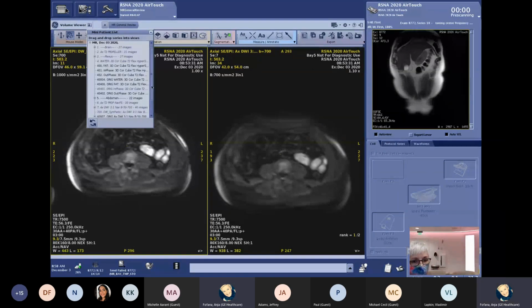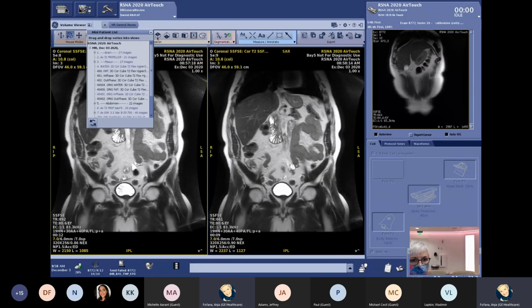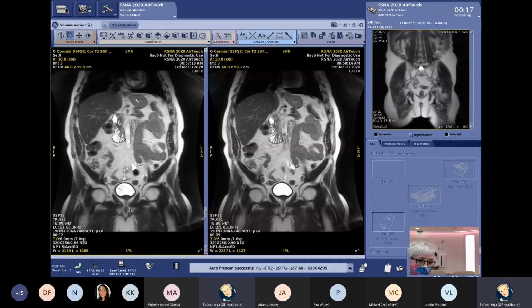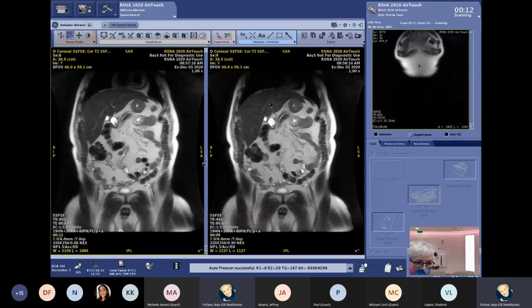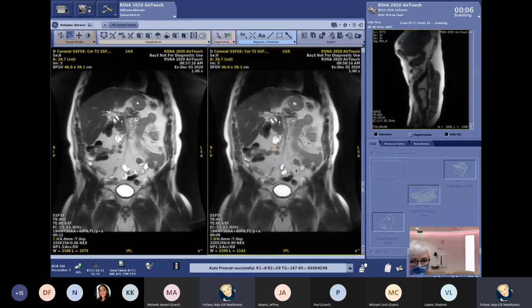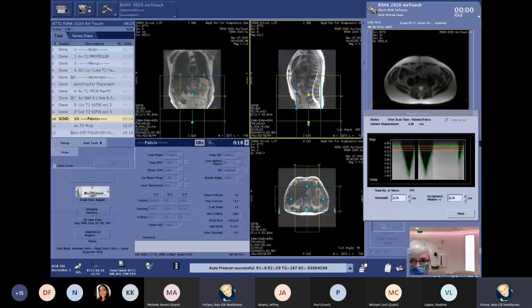So then I can go ahead and we can compare the two single shot sequences we just did. Remember, we picked a large field of view. And what we did here is we can cover the liver and the pelvis with one coil. You see, we are almost halfway in his femur here in one scan. And the difference between those coils is the acceleration factor. So on the left hand, let me just quickly prescribe the slice in the prostate, and then we can talk a little bit more about that.